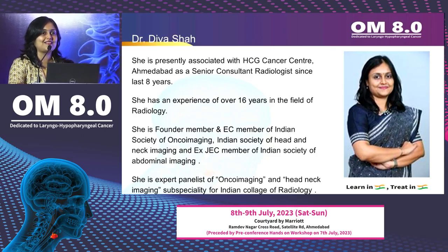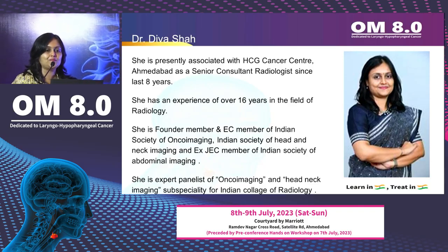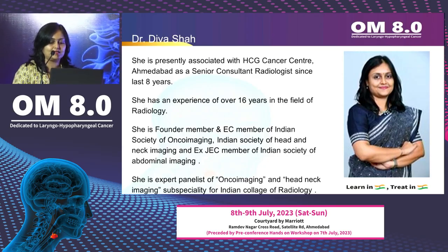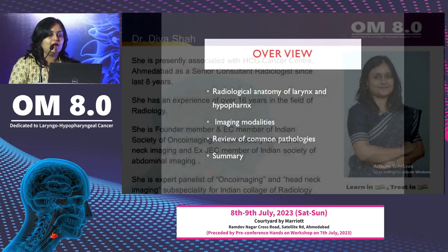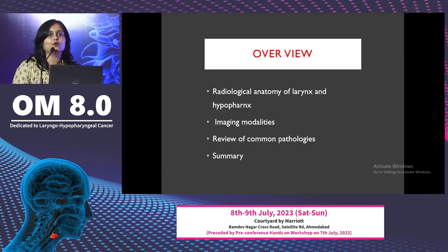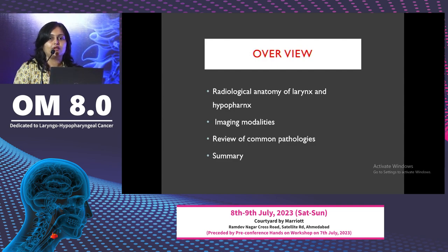And I think all of us are now very much acquainted with the radio anatomy and cross-sectional imaging in larynx and hypopharynx. So to begin with, the radiologist plays a very integral role in evaluation of laryngeal and hypopharyngeal pathology, for the evaluation of the disease, local extent, staging of the cancers, and post-treatment surveillance. In the next 20 minutes, we will overview the radiological anatomy of the larynx and hypopharynx, various imaging modalities, review the common pathology, and then summarize.